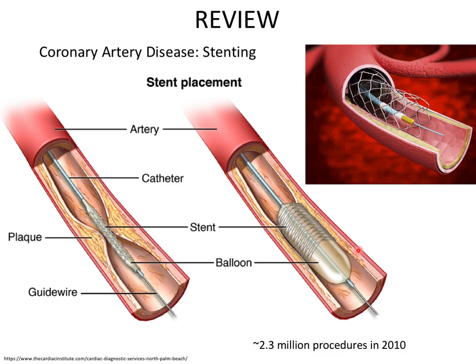My answer is I believe it bulges out. You're going to force tissue and matter outwards, and so the whole radius is going to increase. That's not really observed on X-ray coronary angiography when you're doing the procedure. What is observed is when you inject dye post-procedure, you see the lumen again. You don't really see what's on the outside. So it's a very good point.